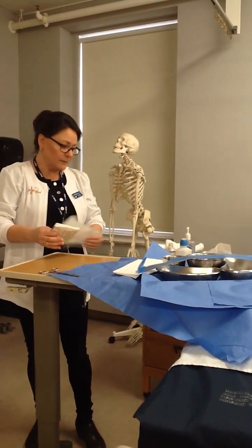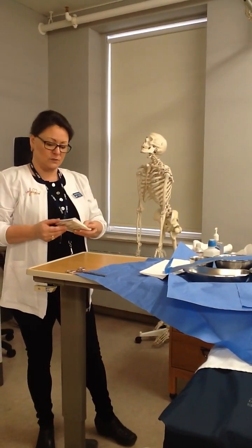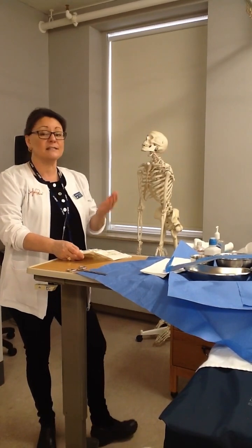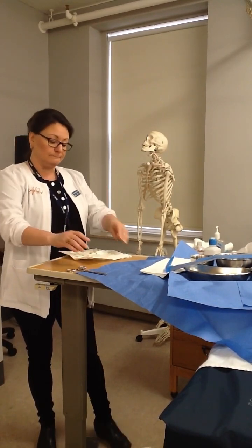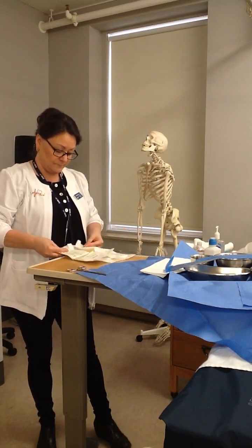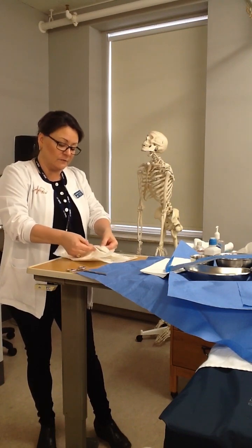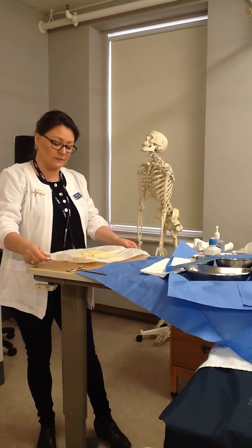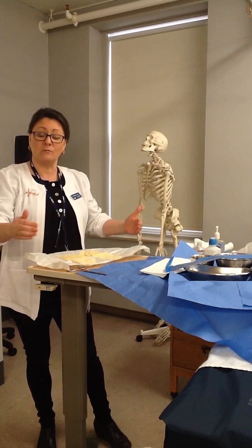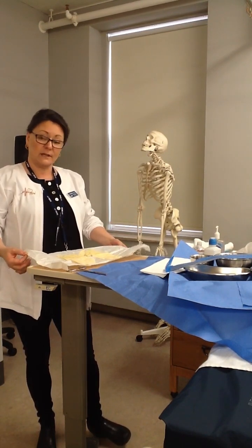So I can move to the end of my bedside table. I have my sterile tray in view, and my patient is in view, and I'm going to apply my sterile gloves. In some of the disposable catheter trays, even the gloves are in them. I'm going to fold back the edges, reach my fingers inside that little flap, pull open my package and give a little tug. Where I'm hanging on represents that 1 inch or 2.5 centimeter unsterile border. I can touch there.